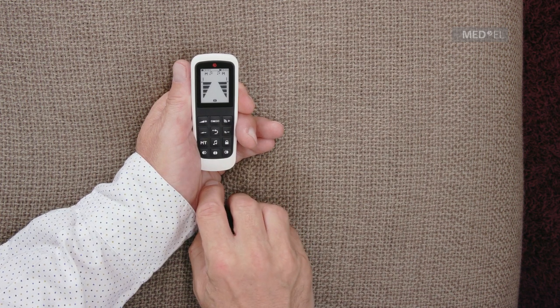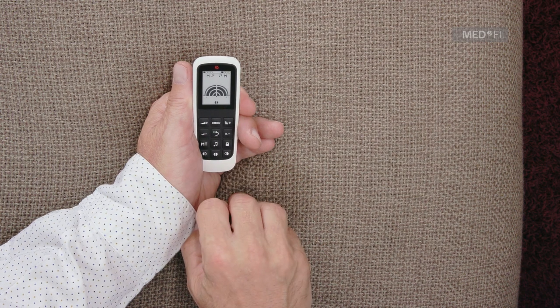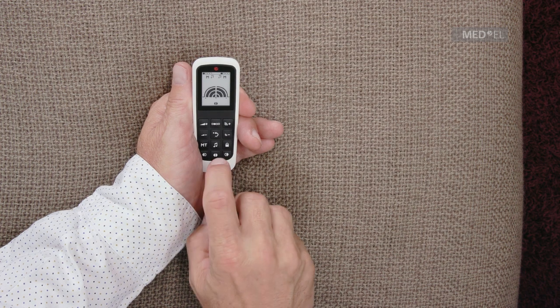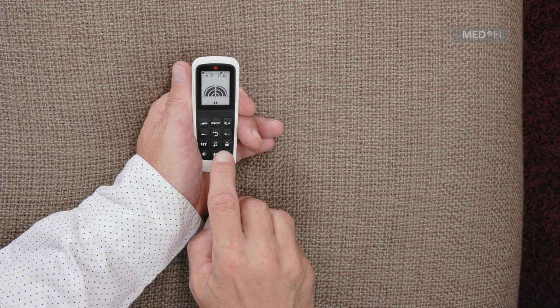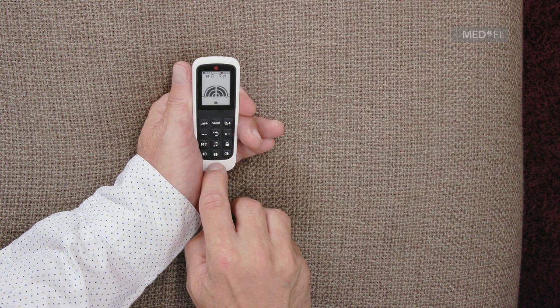To increase the sensitivity of your audio processor's microphones, press the upper sensitivity key. This will increase the range of the microphones, but may also increase levels of background noise. To decrease the sensitivity, press the lower sensitivity key.